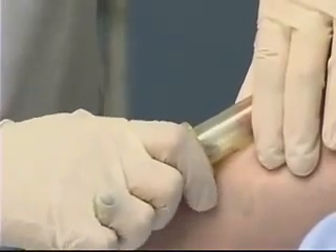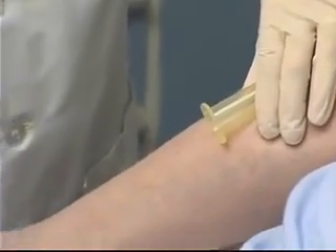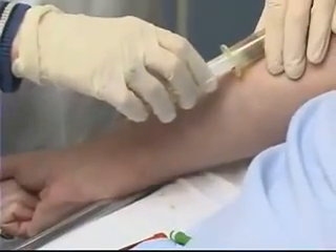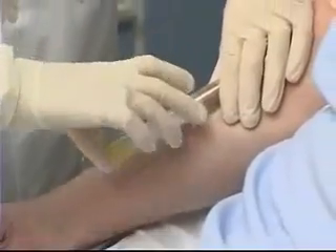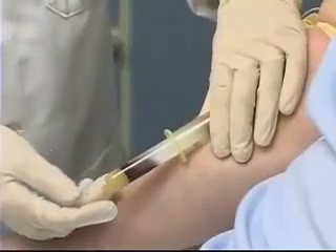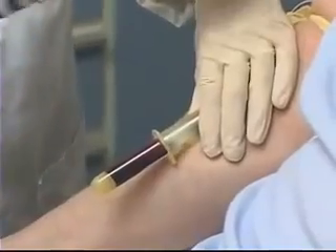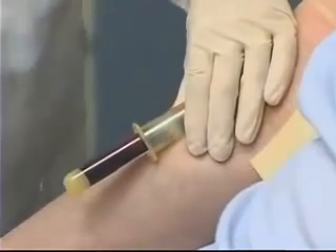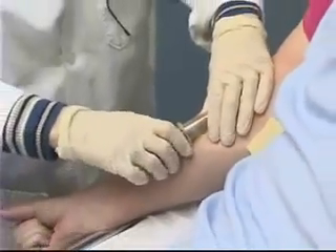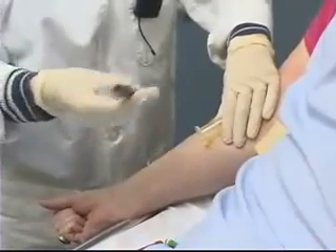Once I've filled that tube adequately, I can pull it out of the holder, giving it just a little shake. Taking the second tube and again pushing the tube through the needle. This is my last tube, so when that gets to be about halfway full, I can release the tourniquet. I can then pull the blood collection tube away from the needle, taking it out and again giving it a little shake.